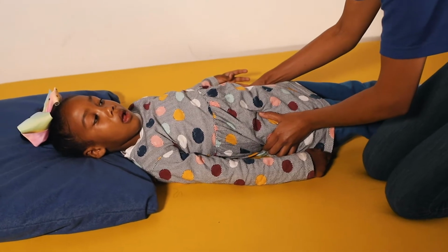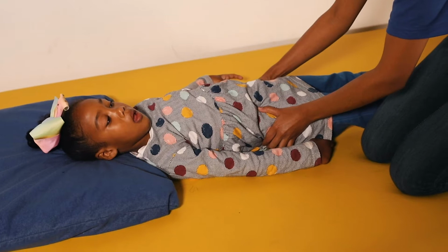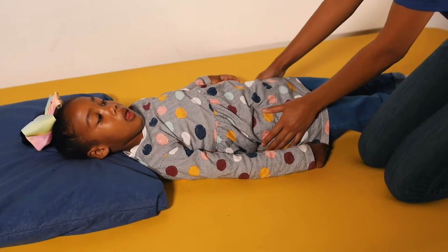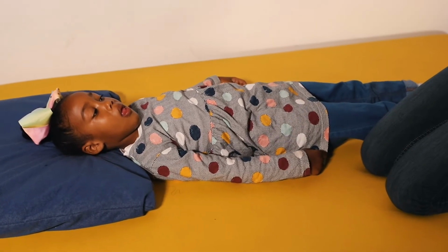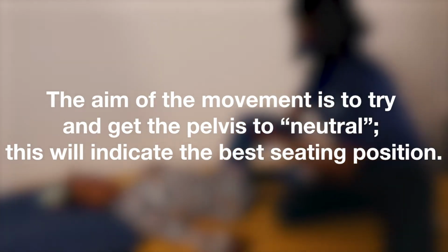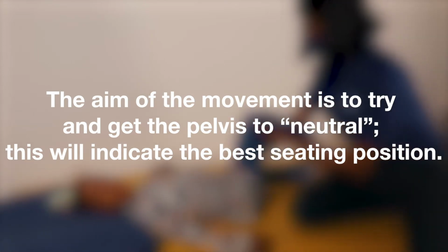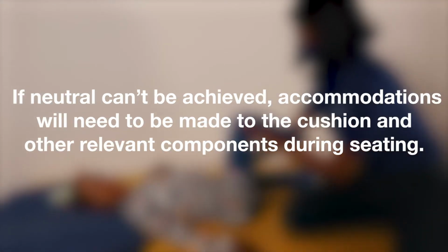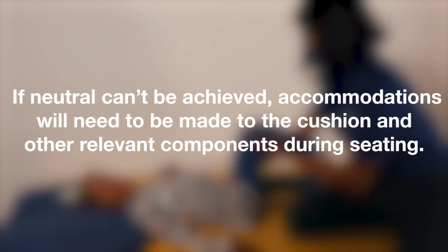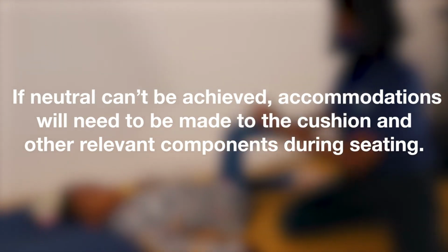This will help to assess whether the client has one side of the pelvis higher than the other side and whether it's fixed or flexible, as this will affect the seating. The aim of the movement is to try and get the pelvis to neutral. This will indicate the best seating position. If neutral can't be achieved, then accommodations will need to be made to the cushion and other relevant components during seating.